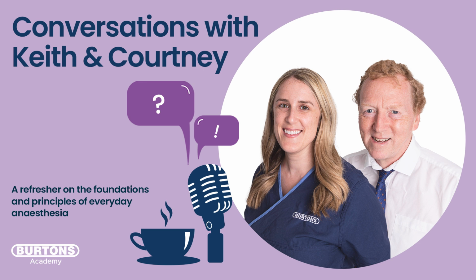Yeah, that was a brilliant point, really, Courtney. Absolutely. We made the assumption, haven't we, that the oxygen going to the patient is what we've delivered, set up on the machine or the concentrator or whatever. But there's a lot of factors that we discussed before that could go wrong. And you're absolutely right. Someone turns the nitrous up, someone turns the oxygen down. All sorts of things can happen. So it would be really nice, in the absence of blood gas, which you don't have to have, what would give you far more confidence would be something that told you the inspired oxygen concentration for your patient. Actually told you what it was.